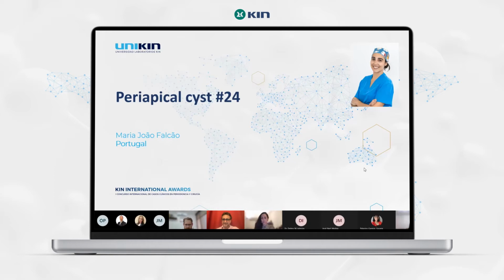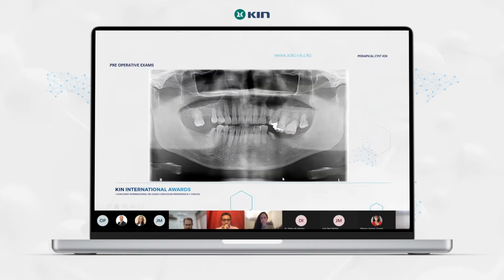So my clinical case is a periapical cyst in the root of the 24. A 50 year old male patient came to my appointment with an acute abscess and pain in the second quadrant. We did an X-ray, as you can see here.